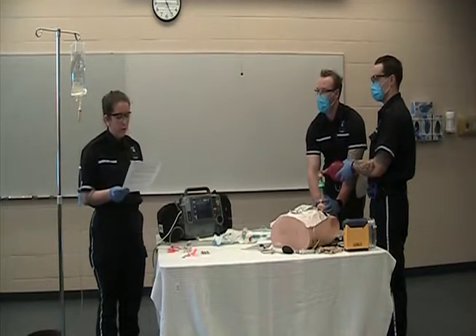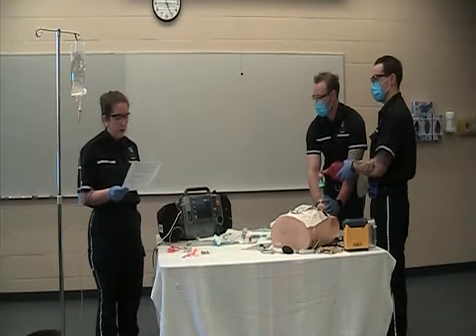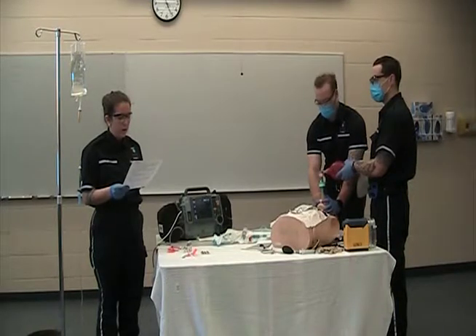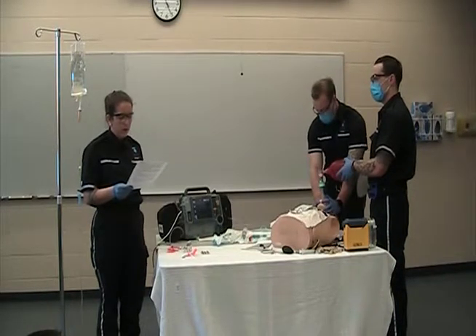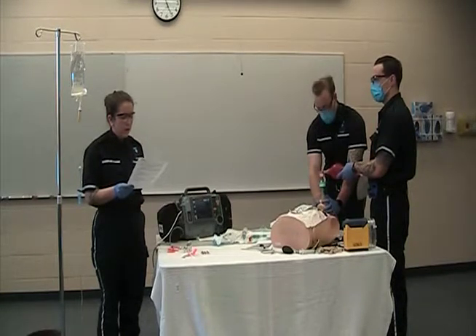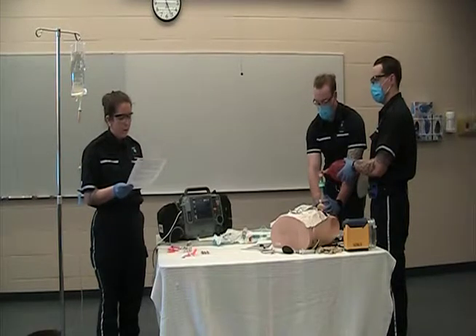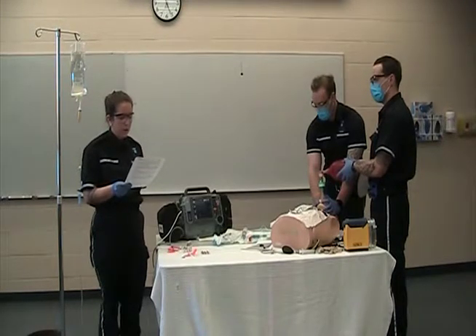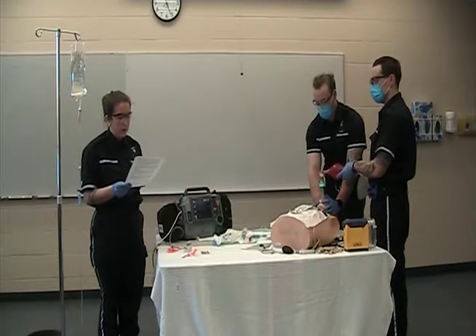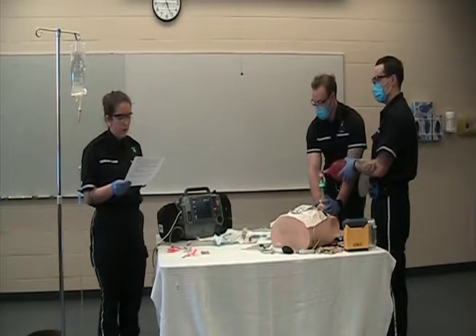Monitors on with ETCO2 connected? Yes. Vital signs have been assessed and considered? Yep. Okay. Suction tested? Yep. McGills are near the patient's head? Yep. We have our laryngoscope with appropriate blade? Yes. ET tubes? Yes, perfect, with the 10 ml syringe attached. Stylet and bougie if we need it. Yep. EDD, rescue airways. Yes. Cric kit and basic airways. Yes. Okay, and ETCO2 is working. Yes. And we have our ETT holder under the patient's neck. Yes.